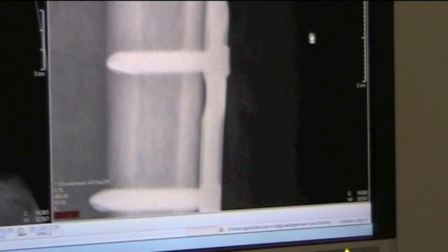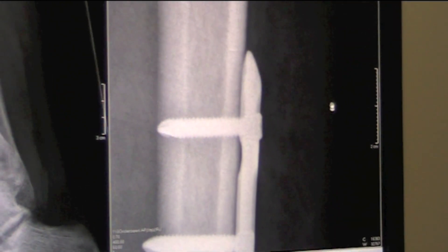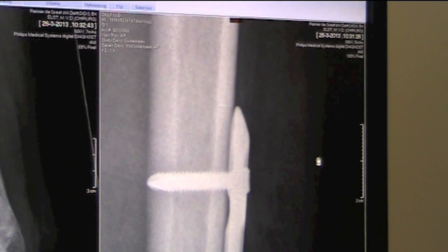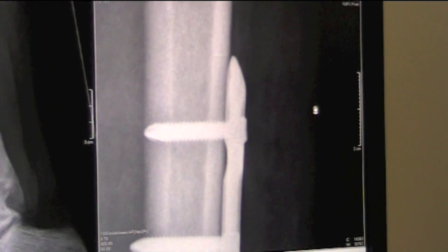What you do is put this on the periosteum — it's very adjacent to the bone — and you can shove it under the soft tissue envelope. Under X-ray control, you slowly move it upwards, and you take away the soft tissue envelope from the periosteum. That's exactly the place where you can place this plate.